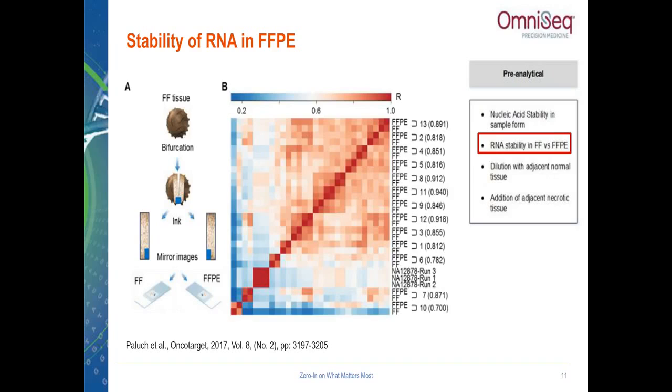And then the FFPE specimen went through processing, and then when it was mounted in paraffin, it was mounted with that ink spot up, so that we knew we were exactly comparing the same faces of one piece of frozen tissue versus the same section of FFPE tissue. And this shows 13 samples that we did in this study that we published. And as you can see, there was very good correlation between the FFPE and the FF. So this was our demonstration that FF was concordant with FFPE.